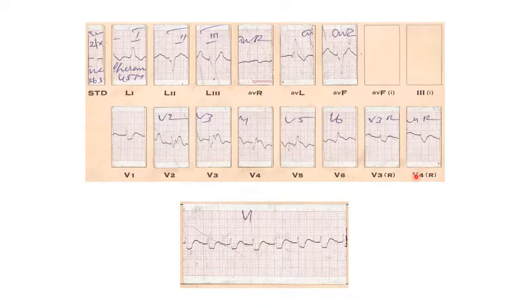Because discordance is there between the ST and T. That's not the reason. Why is it that you are able to diagnose previous myocardial infarction in patients with right bundle branch block, while in patients with left bundle branch block you have got a difficulty? This is because of the septal activation, sir. What do you mean by that? Septal activation normally is from left to right.